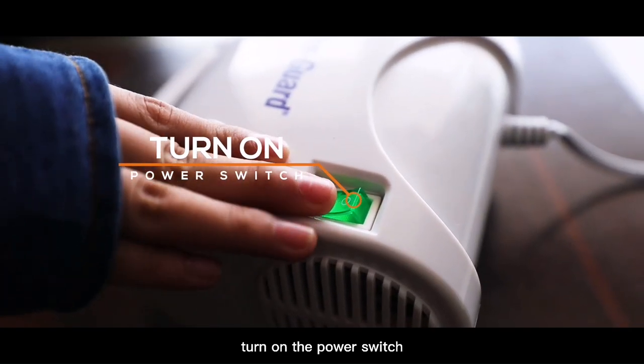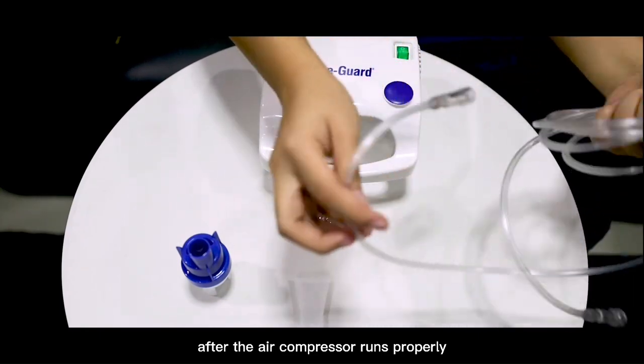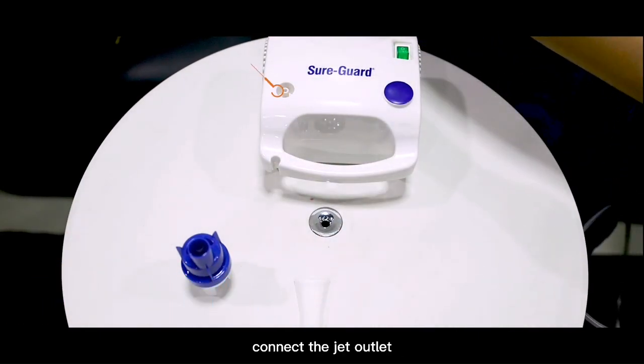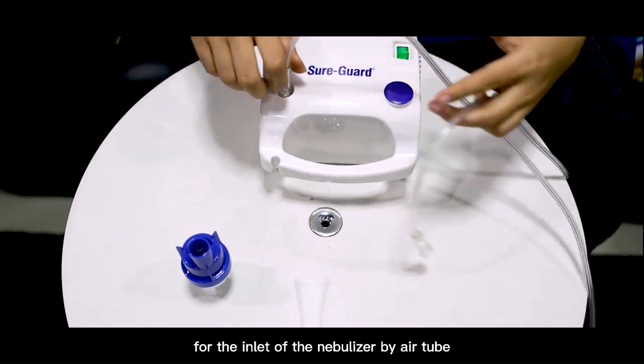Turn on the power switch. After the air compressor runs properly for 1 to 2 minutes, connect the jet outlet of the air compressor to the inlet of the nebulizer by air tube.